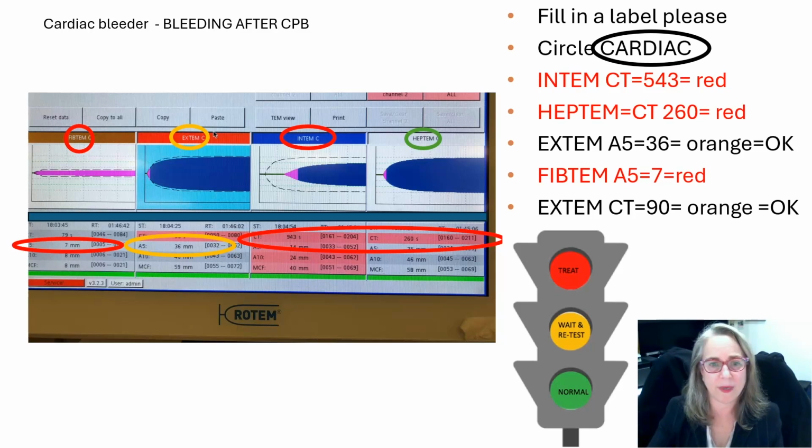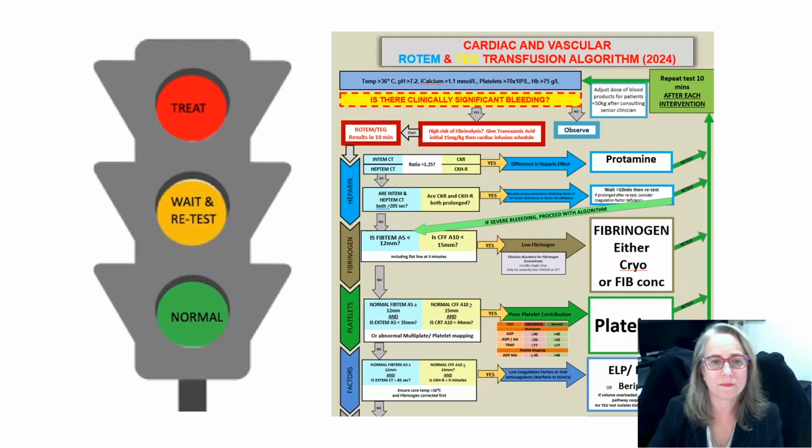FibTem, XTem, INTem, HepTem. Hopefully you can see the abnormality here. There are some things that are very red. Comparing it to our algorithm.